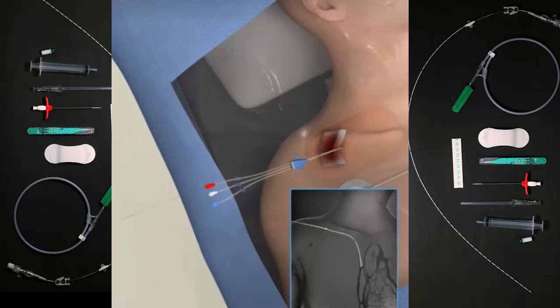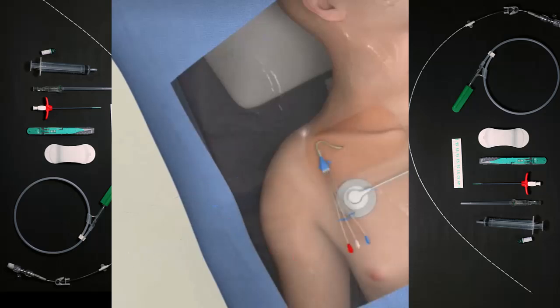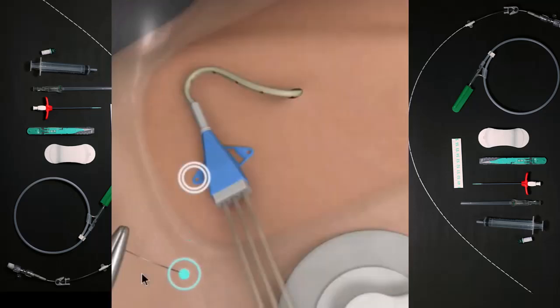Place the catheter over the guidewire and begin to insert the catheter using a rotating motion. Slide the guidewire slightly out of the skin to aid manual control of the guidewire while advancing the catheter. Insert the catheter until the tip is at the junction of the superior vena cava and the right atrium.